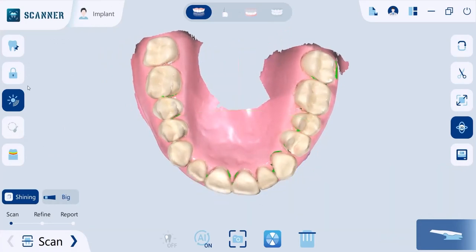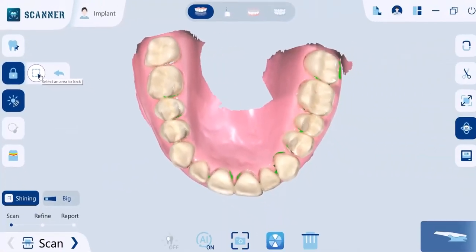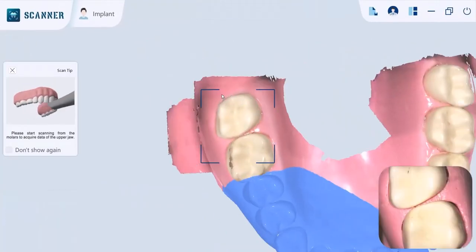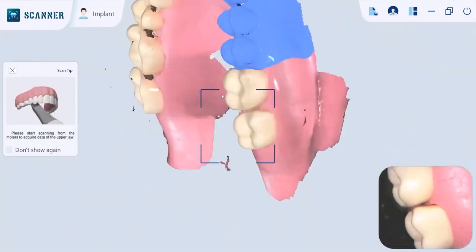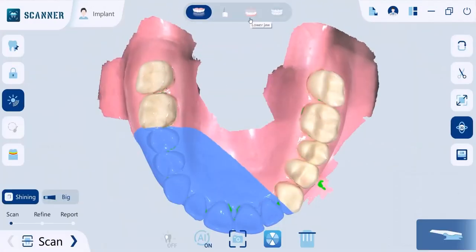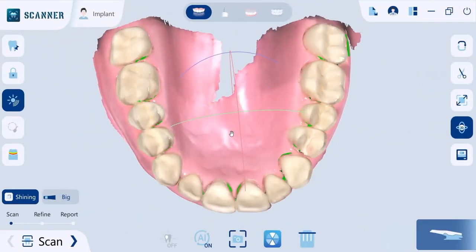During scanning, if you want to keep a certain area on the model without further updates, you can use the lock area tool to prevent it from being updated by additional scanning. As you can see, the blue area does not change. Also, green highlighting on models shows you areas that need further scanning, and small holes are automatically filled.